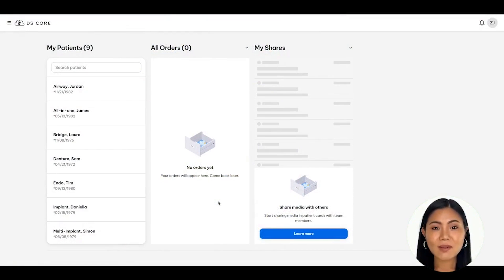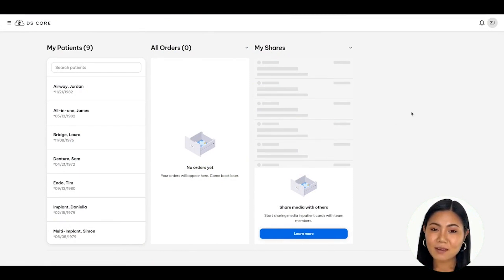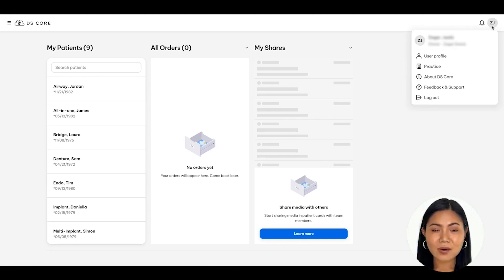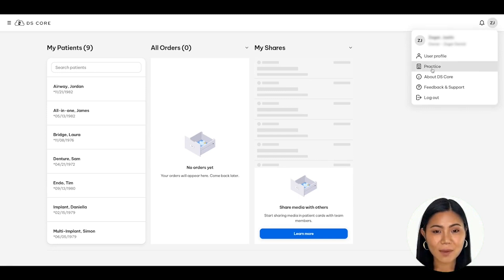Once you have logged into DS Core, you'll see your main dashboard. Navigate to the user profile menu in the top right corner. The user profile will have your initials in a circle next to the notification bell icon. Click on your initials to open the menu.